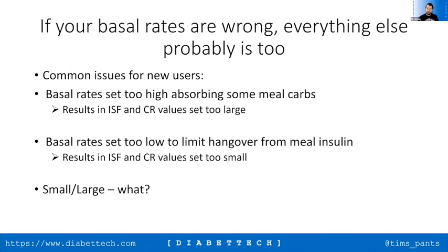And this is one of the key things about Android APS and the objectives, and why you have the objectives there. Historically, when you jumped onto Loop or onto OpenAPS, you didn't have any process to go through to figure out whether your levels are right or not. The recommendation was always to open Loop, follow what the system was recommending, and then determine whether or not your settings were correct.